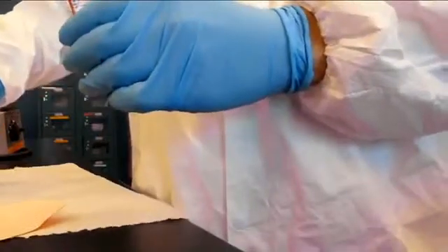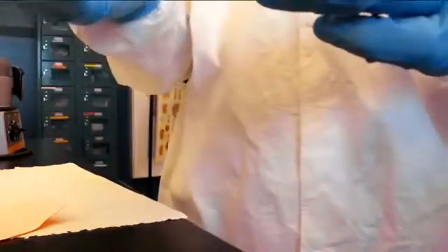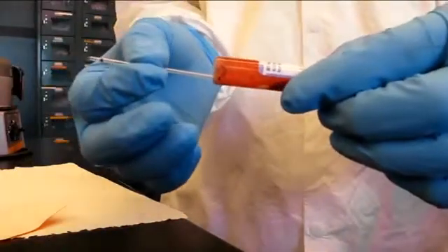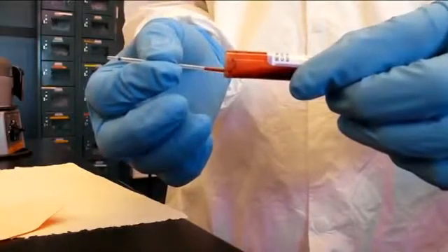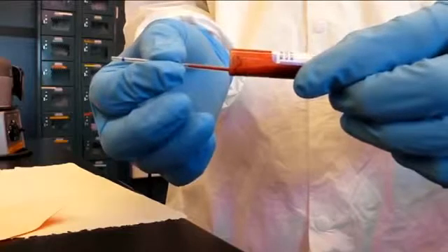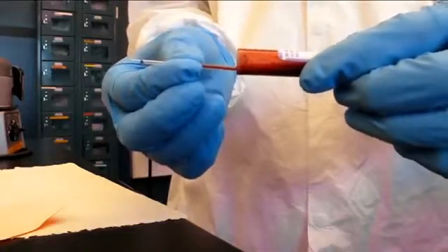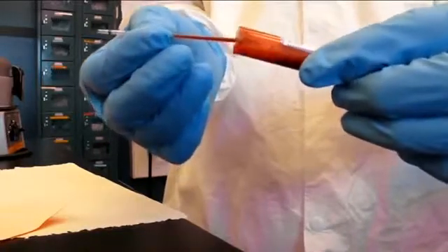Since our sample already has anticoagulant, use the capillary tube with the blue band. If this were a finger stick collection, a capillary tube with a red band should be used instead. Carefully angle the whole blood and insert the capillary tube. The capillary force should automatically aspirate the sample. Make sure the blue band is facing away and let it fill until it is at least three quarters full.